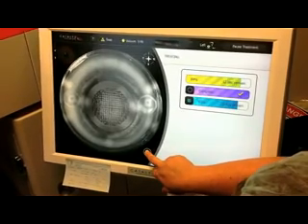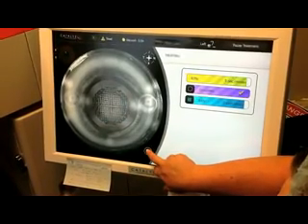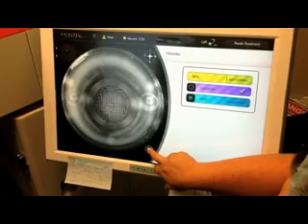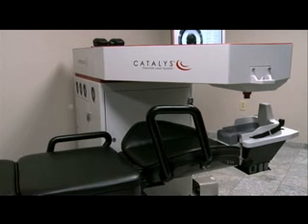And would you opt to have this done versus the traditional standard cataract? In a femtosecond. I've done so many of these, and this thing is so precise that it leaves very little to chance. Patients can move. Their eyes can turn during surgery, and all those introduce errors that sometimes can lead to complications. Not often, but sometimes can, and this obviates a lot of that. So it's an extra level of safety as well. So if I could be sure I was running the machine, I'd lay down in a second.